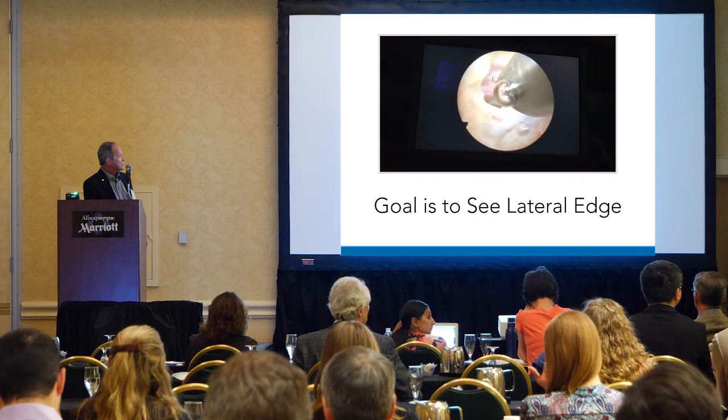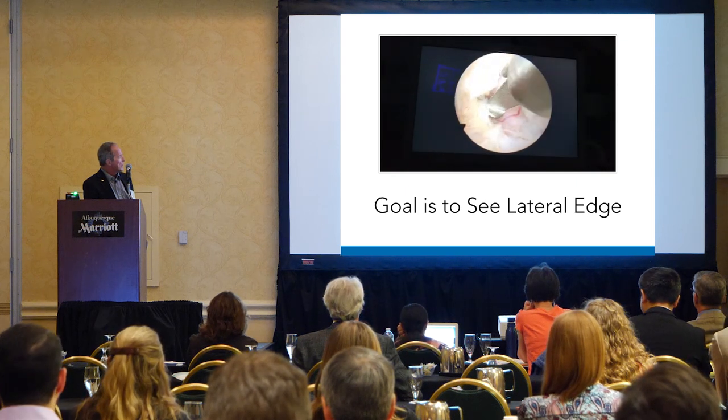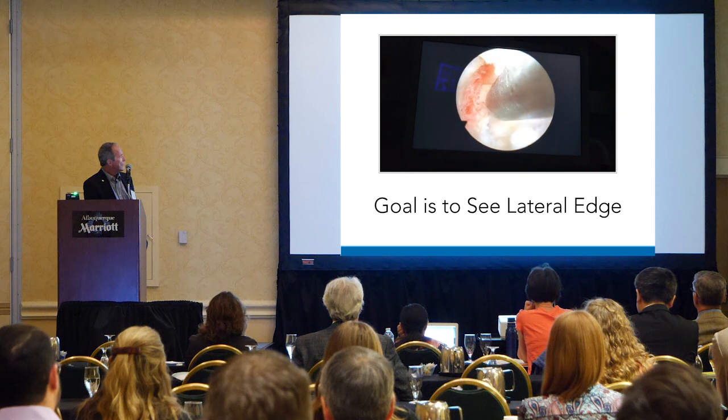The goal here is to find the lateral edge of the thecal sac. That's critical. There's a variable takeoff to the exiting nerve root. But before you poke around or do anything else or find the exiting nerve root, you have to find the lateral edge of the thecal sac. So the goal is to see it, so we're going to use the Kerrisons. There we see the lateral edge of the thecal sac, right there.